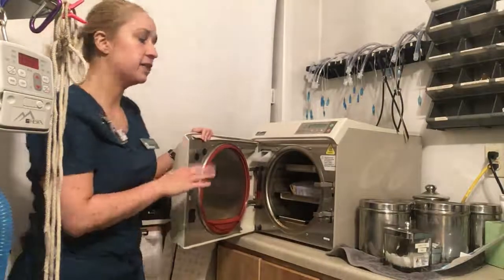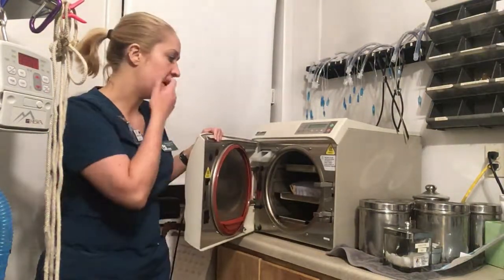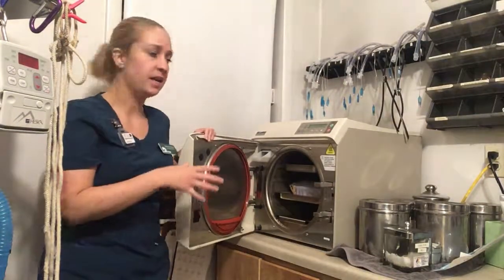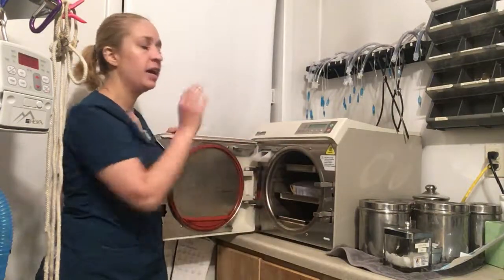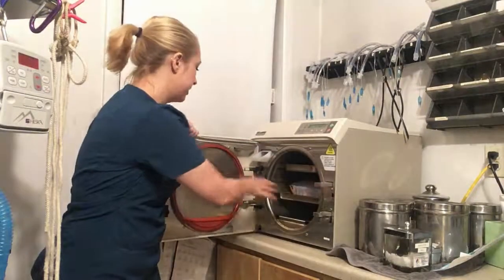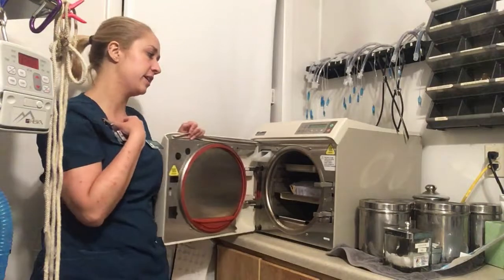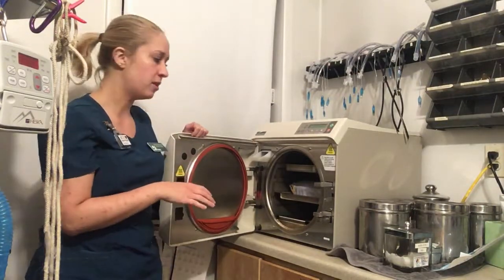The monthly cleaning is a little bit more involved, as you can imagine. It requires you running through the water a couple of times. You'll run some speed cleaner through the entire thing, and you'll run a couple of different cycles, and then you're also going to take everything out again and really get it really clean with the speed cleaner, things like that. You really want to make sure you're only using distilled water.